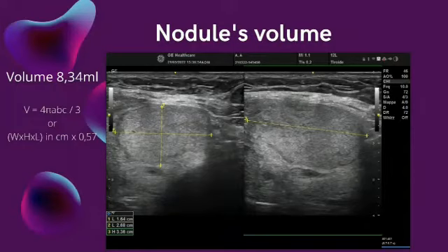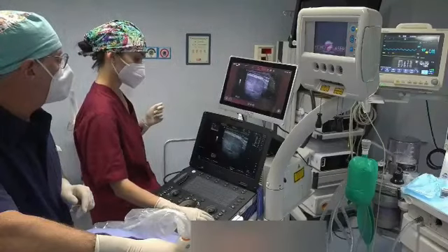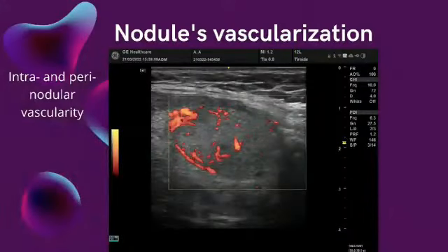The ultrasound phase begins. The size of the nodule is calculated with the ellipsoidal equation. We proceed with the study of vascularisation at colour Doppler and power Doppler. In our case, the patient has both intra and perinodular vascularity.